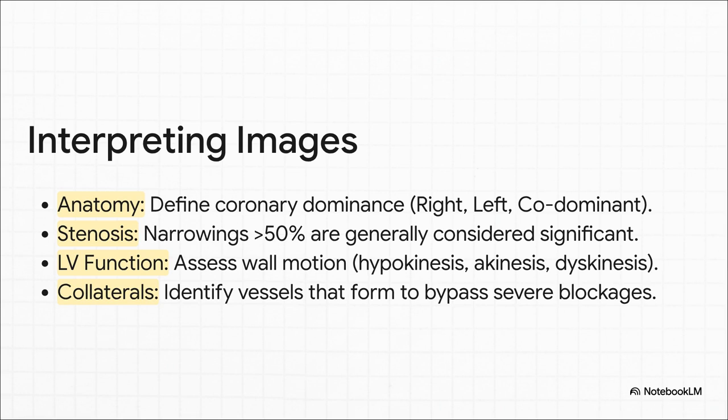After that, we often do a left ventriculogram. That's a bigger puff of dye right into the main pumping chamber, to watch how the walls are squeezing. We're looking for areas that are weak or hypokinetic, which tells us there might be some old damage there.